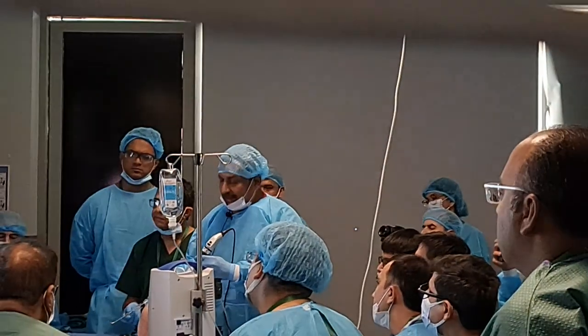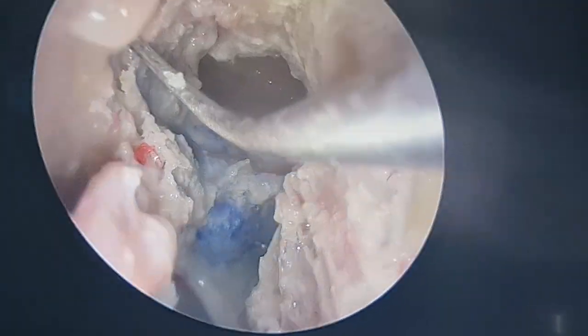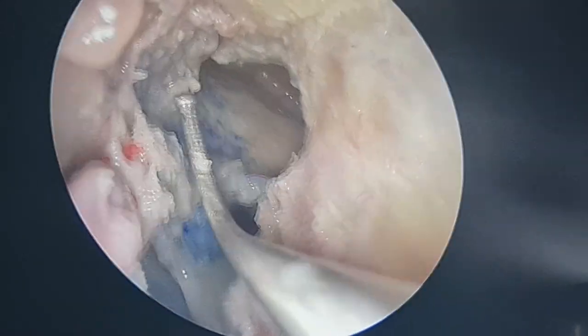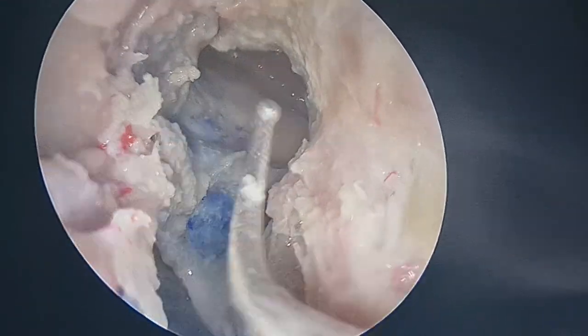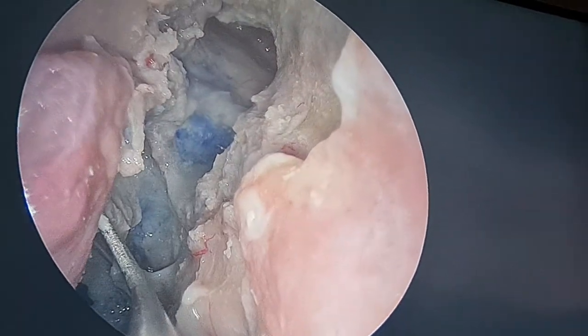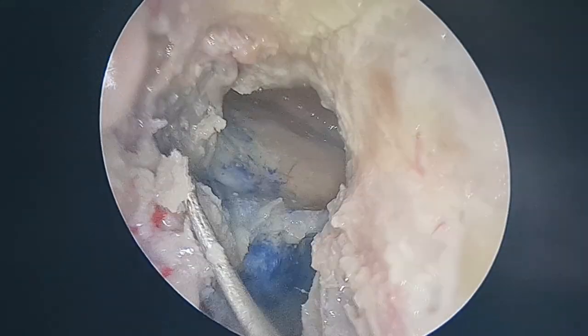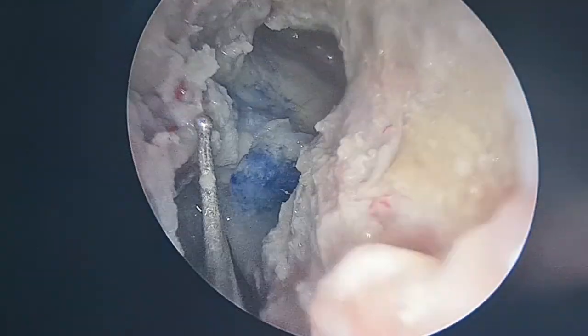Now, if you have a pathology far laterally on the opposite side also. Suppose I am operating on this side and the patient has isolated frontal sinusitis on the opposite side also. What I will do besides this, I will do intersinus septotomy along with the septotomy for the lateral part, the modified subtotal. So there are various permutations and combinations according to the need.